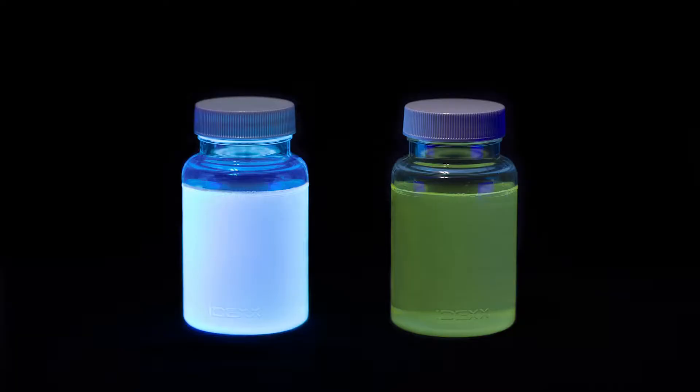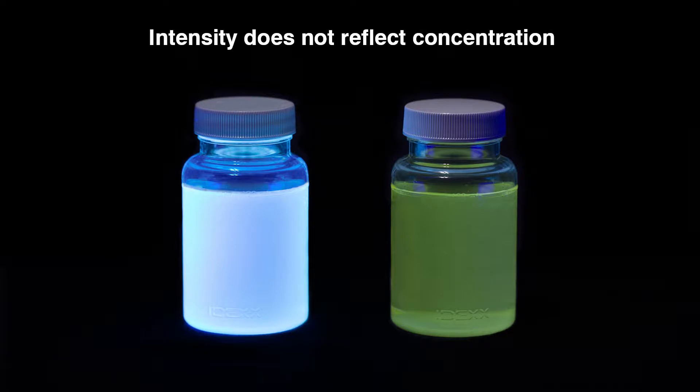After incubation, view the sample under UV light in a dark environment. Shine the light away from your eyes. Keep the light within 5 inches of the sample. Any blue fluorescence means a confirmed positive for enterococci. The intensity of the fluorescence does not reflect sample concentration.